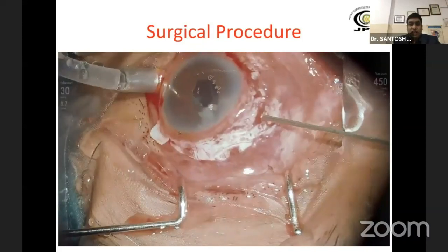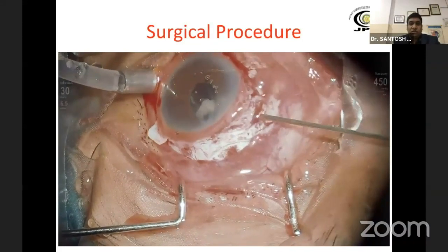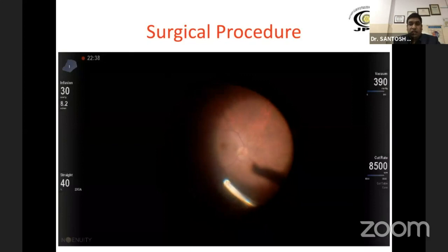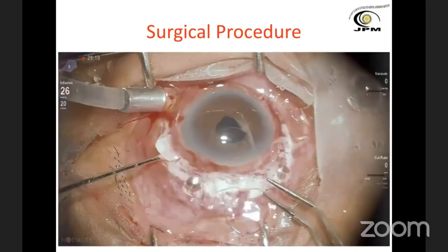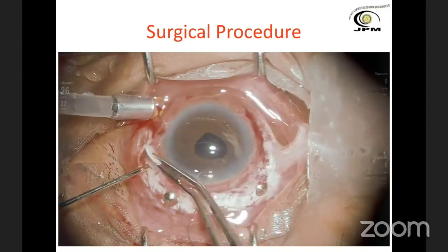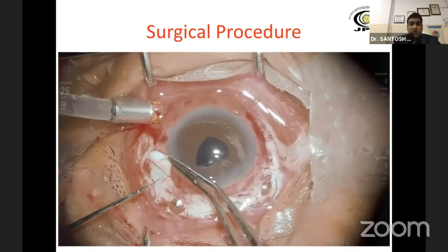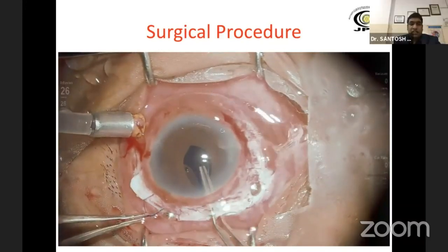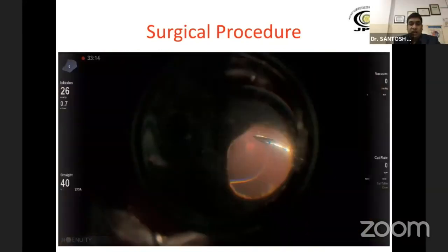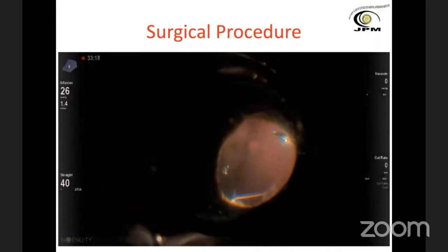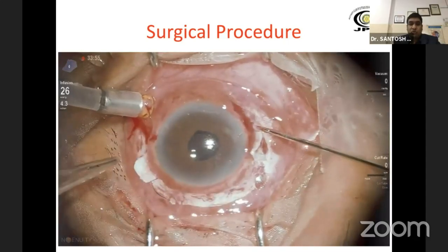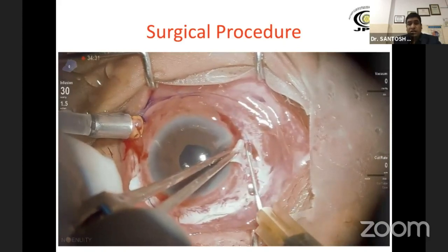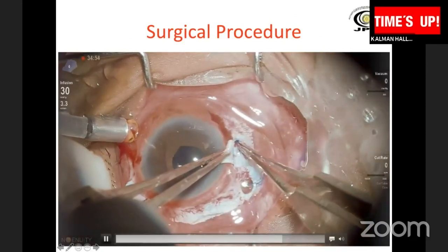You have to take care of the iris, and then it is important to pull all the vitreous from the wound to ensure complete vitrectomy in the anterior segment and at the margin of the iris. Again I am inducing PVD and trying to clear all the vitreous. The IOL is now getting into position. The first haptic is coming out. The trailing haptic must be placed carefully behind the iris. Use a light pipe from the scleral port to help the haptic, and carry out the same procedure with the bent needle to tuck it into position.